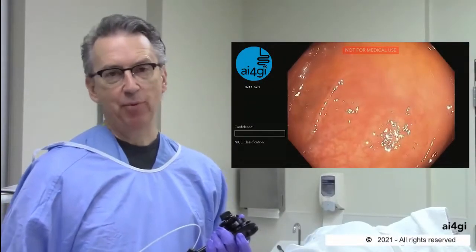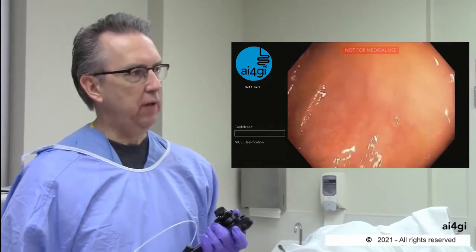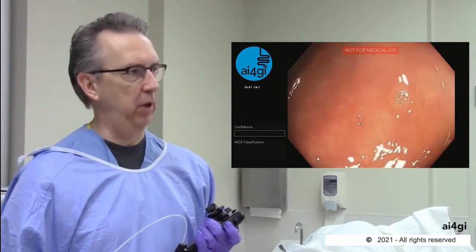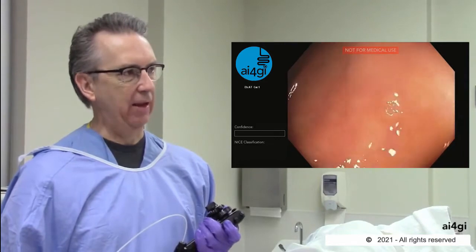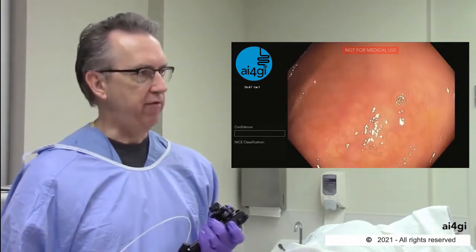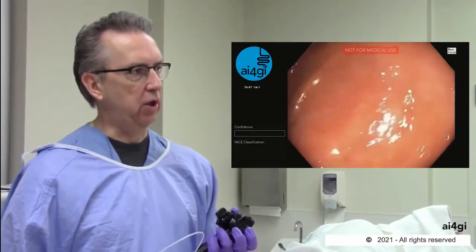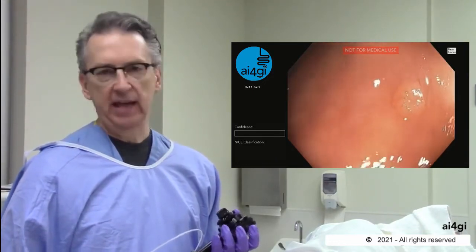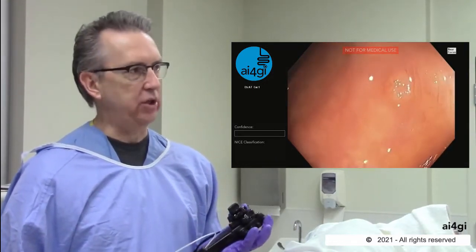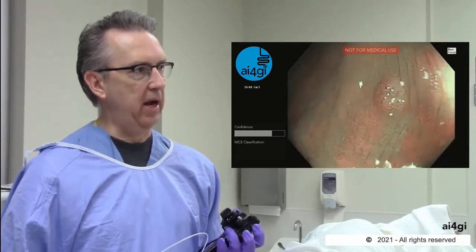I want to demonstrate the AI program in action. There's a very small polyp here, a couple of millimeters in size. In white light, it looks like it has a little bit of a central valley sign in it. I'm going to turn the close focus on, and then to activate the AI, all we need to do is turn on the narrowband imaging.